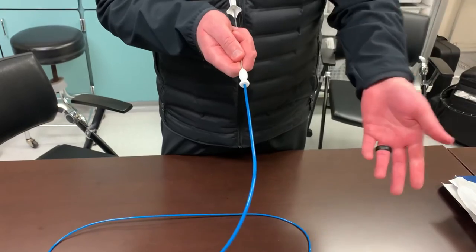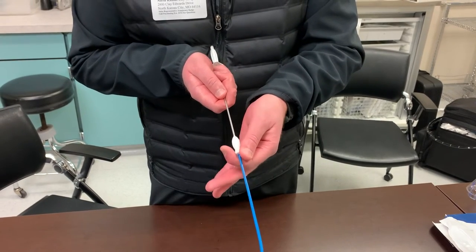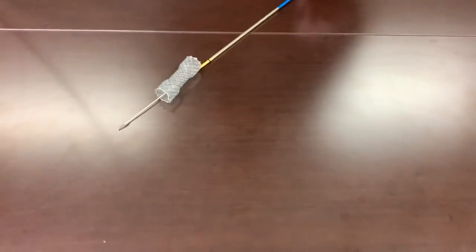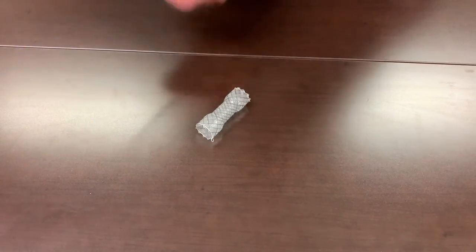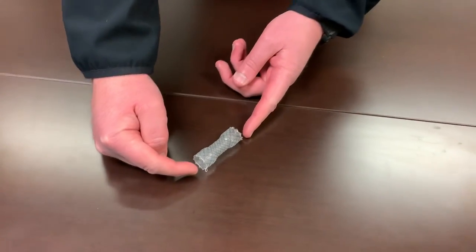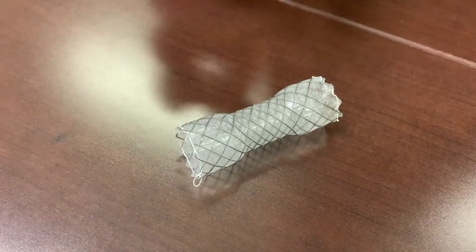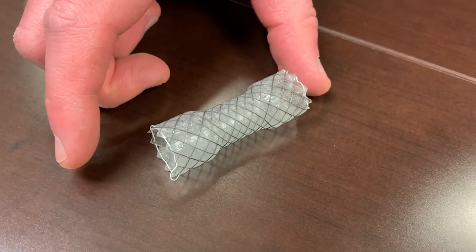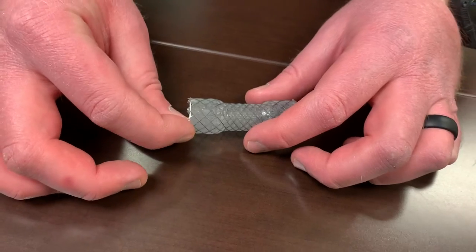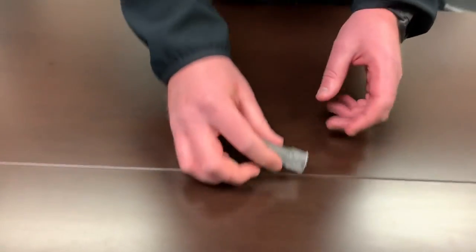Once you've reached the point of no return, tell the physician. If everyone is happy with the placement of the stent, complete deployment by continuing to pull back until the stent opens fully. At that point, the catheter used to place the stent is withdrawn through the middle and the stent remains in the patient. There are pull strings on either end of the stent. A combo grasper or rat tooth grasper can be used to reposition at the time of initial placement, or when it's time for the stent to be removed, a grasper is used to grab the string, apply tension, reduce the diameter of the stent, and then remove the stent from the patient.